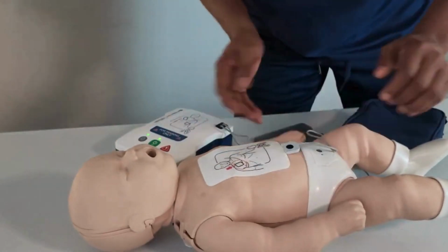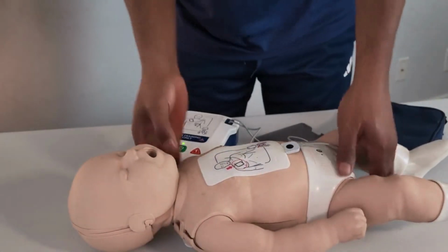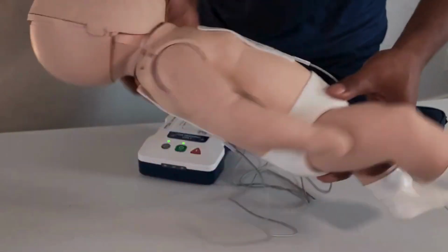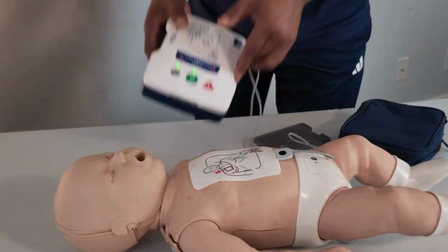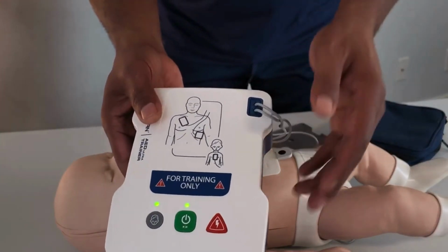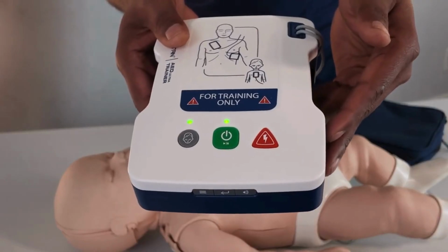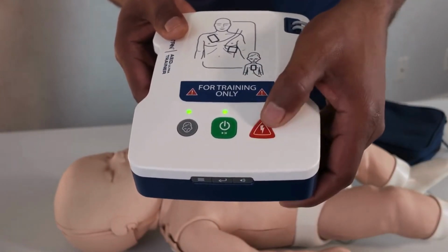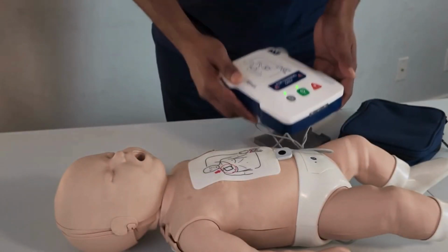Do not touch the patient. Analyzing heart rhythm. Do not touch the patient. Analyzing heart rhythm. Shock advised. Do not touch the patient. Everyone clear. Press the flashing shock button. Shock delivered. Begin CPR.